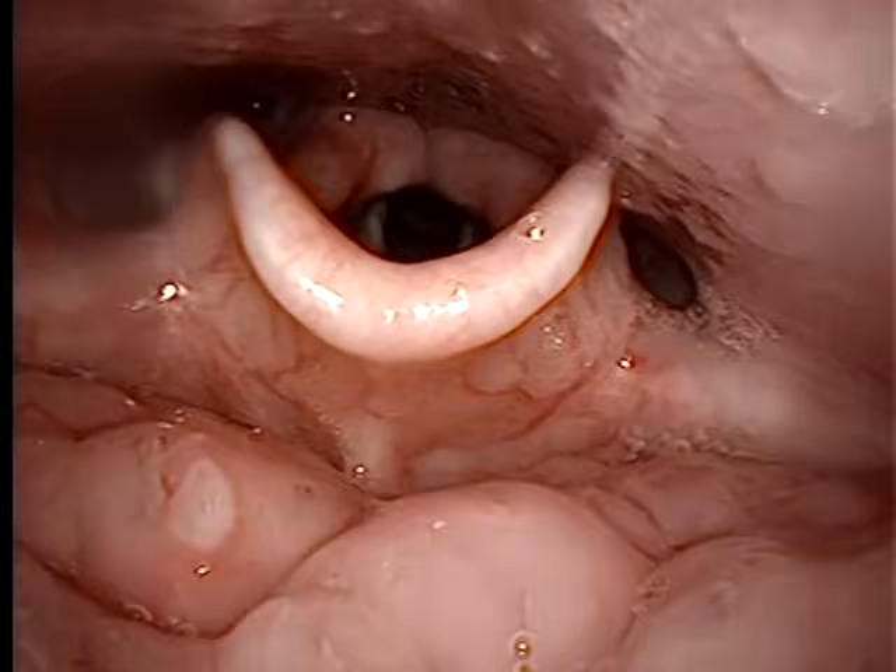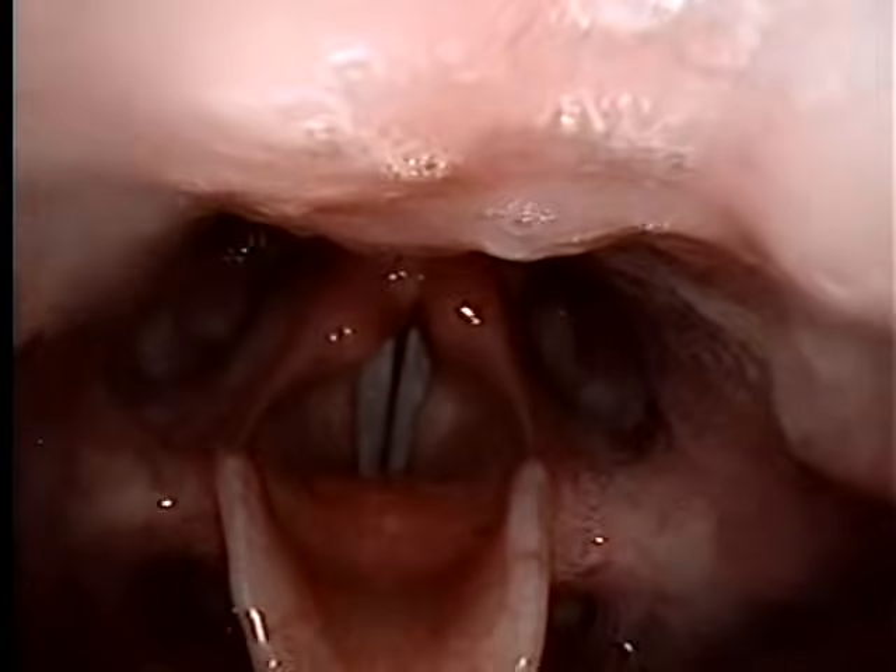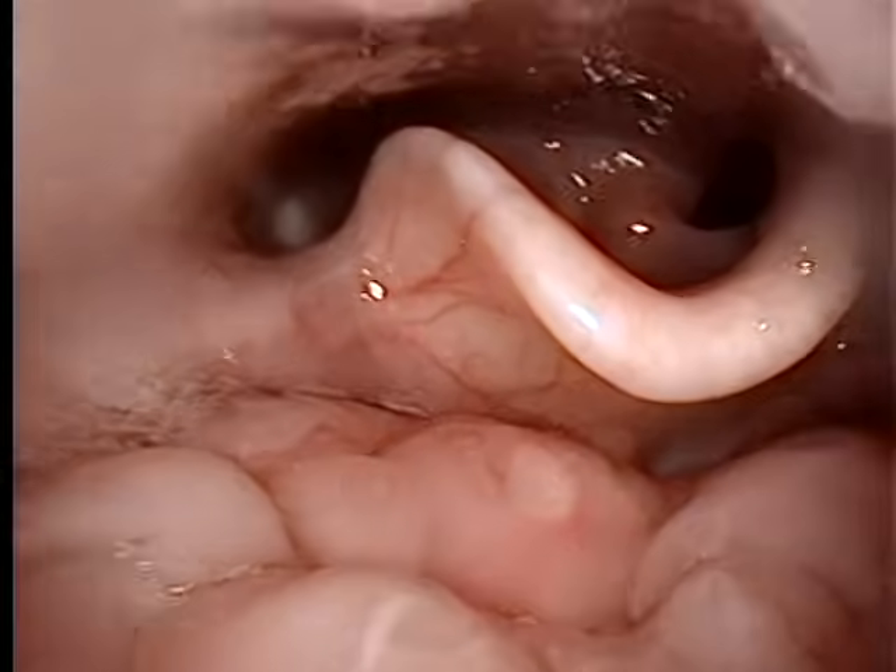Now let's look at the lateral pharyngeal wall. So you do a real high pitch E. Like that? You see how the lateral walls on each side come and squeeze in. Oh yeah.